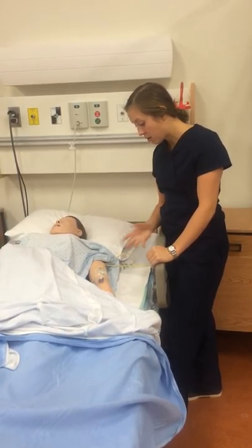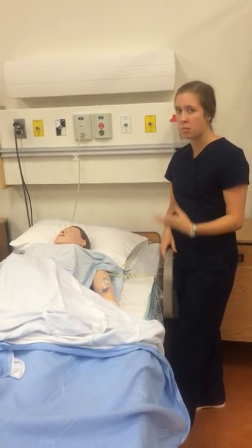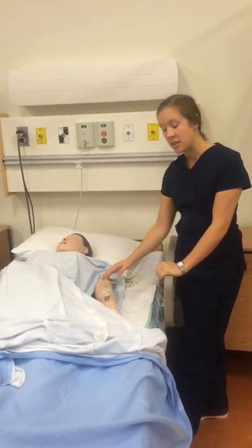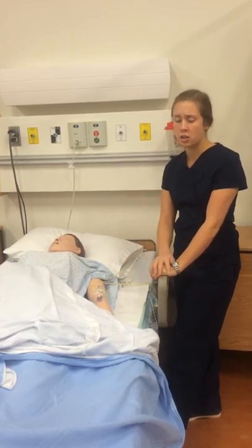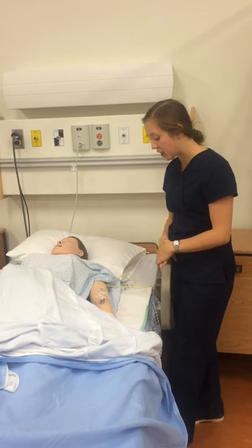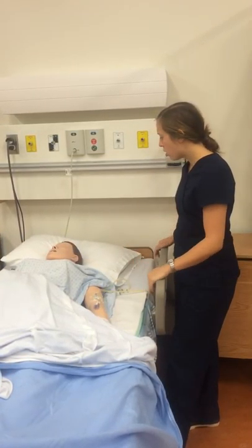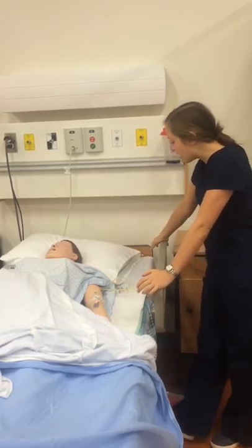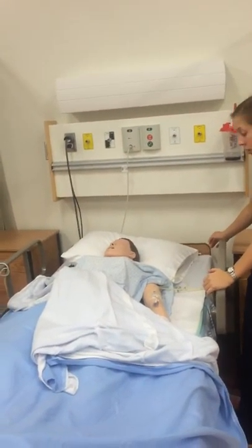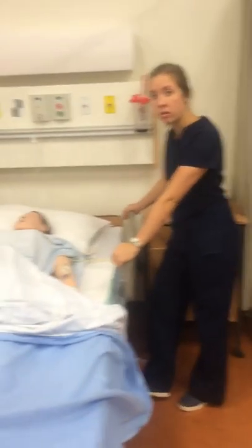So I'm just going to do a quick assessment of your PICC site. I'm looking at the PICC dressing. I'm looking for any redness or swelling, which I don't see. I also don't see any exudate, which is also a good thing. I notice it's a double lumen. I know it's a closed system, so I'll flush with normal saline and not heparin. Usually we give medications in the distal port, but I will check the chart just to make sure what port they've been using to administer medications.